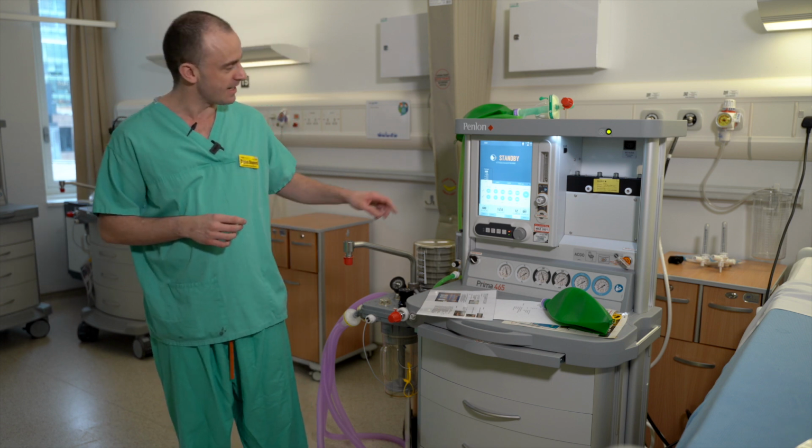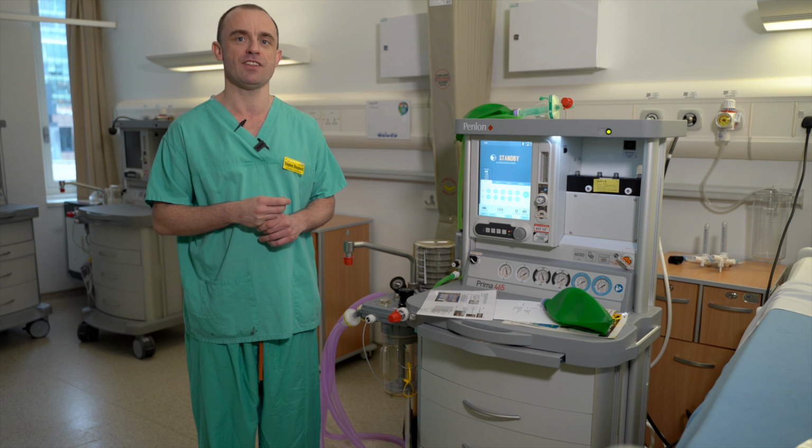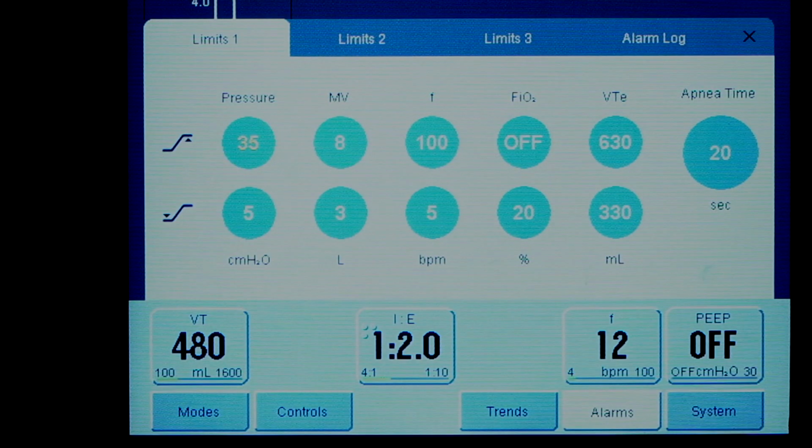The first one of these is the pressure. So this is the maximum or P high pressure that you set. This defaults to a high of 40, and we're going to recommend as a standard this should be set to 35. This can be changed after a discussion with an intensive care consultant depending upon the patient's physiology, but we'd recommend 35 as a maximum in the vast majority of patients.